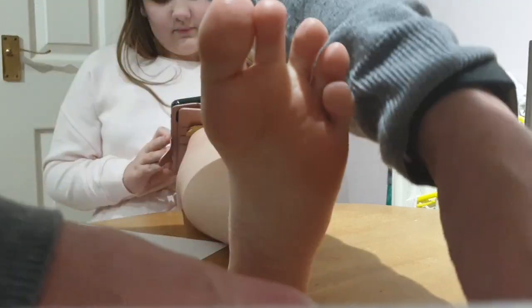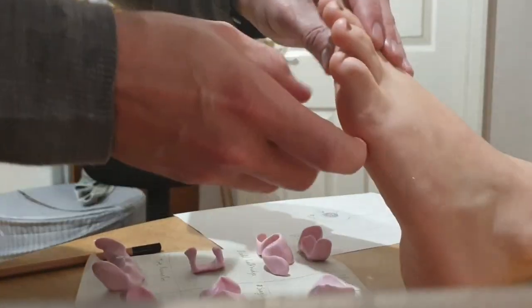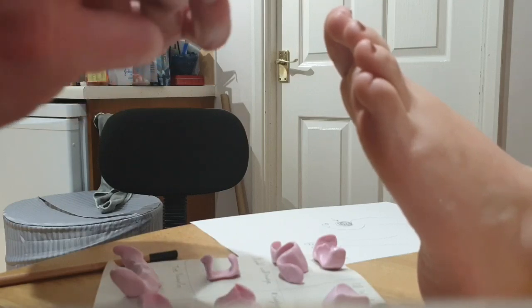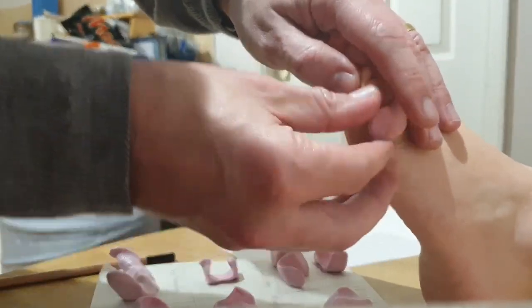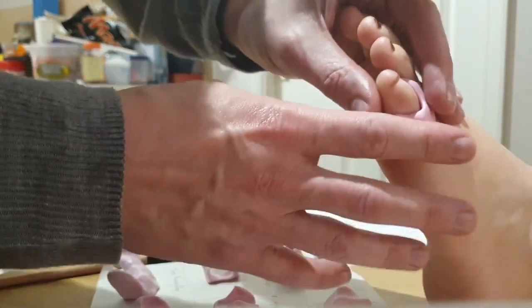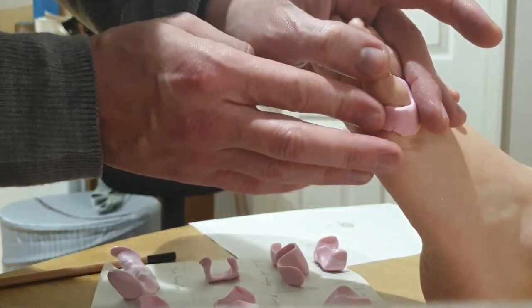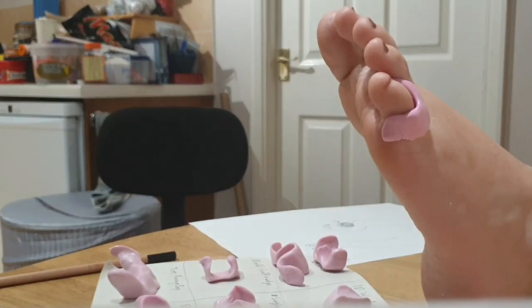The last one is a tail pad — this would be for a corn on the IPJ there. It's essentially what it sounds like: it's a wedge but with a little hook over the top. You rough mold it, pop that in there, and then work a little tail that just flips around the side there, pushing it away from where the corn would be. Just like the dorsal pad, what we're doing is creating something so that when the shoe pushes on there, it puts pressure on that bit rather than just on the knuckle. It's surprising how well these actually stay in place.